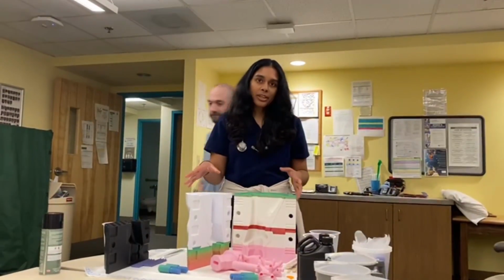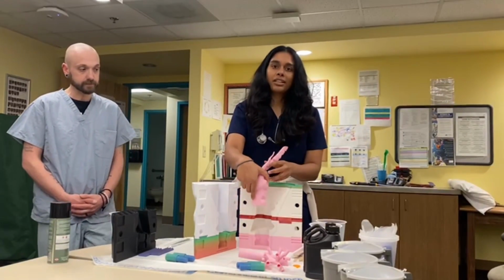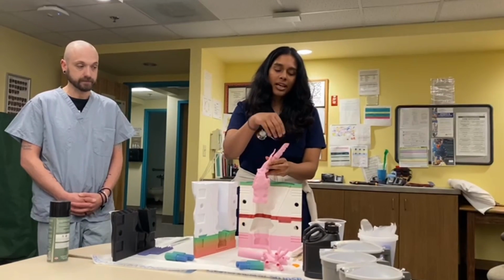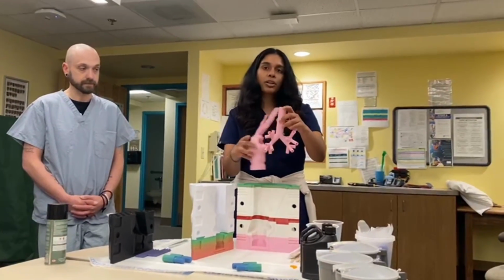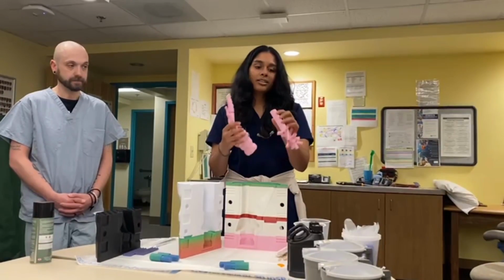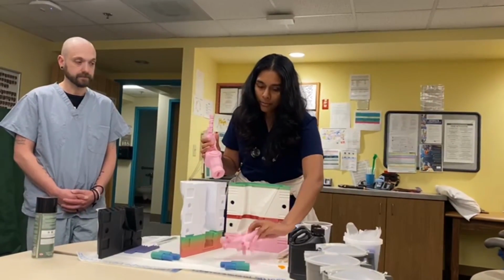So the parts that we have over here are the mold, the inset over here, which is going to be the actual part where the bronchoscope will go through once the mold is filled with silicone. And we have the model for the trachea and the bronchial tree over here, which will attach to the bottom. And for this part, the 3D printed model is the part that the bronchoscope will go through.